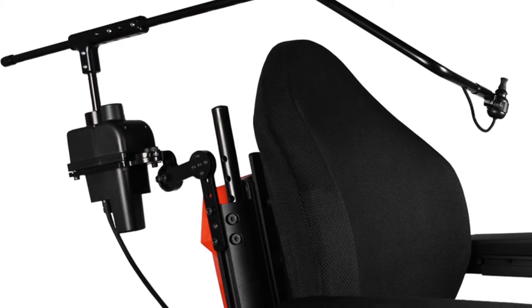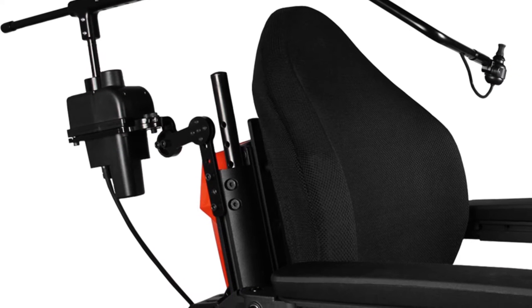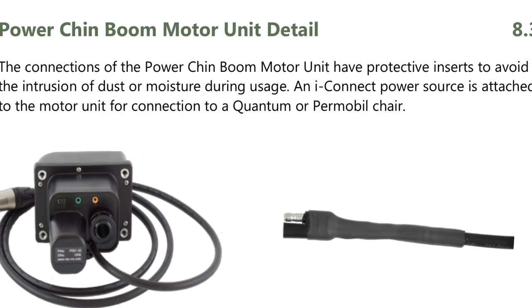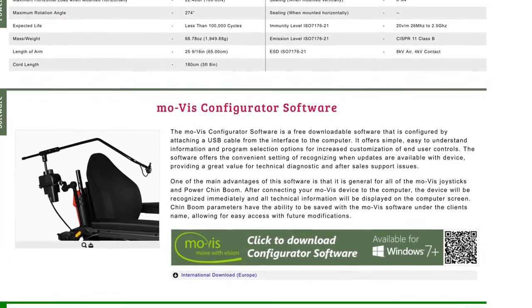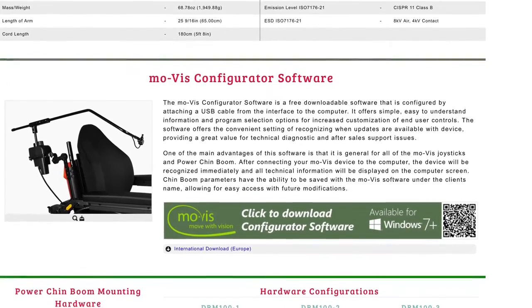The Power Chin Boom is a versatile and innovative motorized mounting arm. It's designed for mounting a chin joystick in the best driving position for the user. With the free downloadable software, speeds, movements, and activation methods can be altered to the user's preferences. The Power Chin Boom offers effective and comfortable solutions for the customer as well as an aesthetically pleasing look.